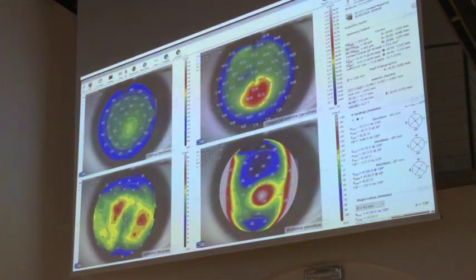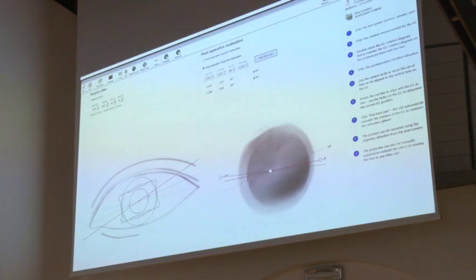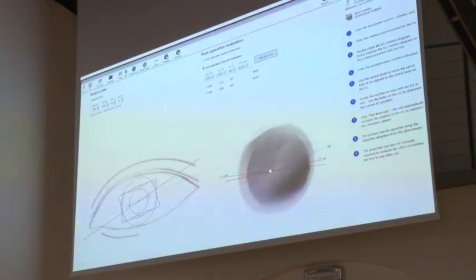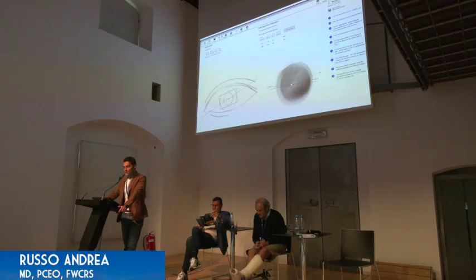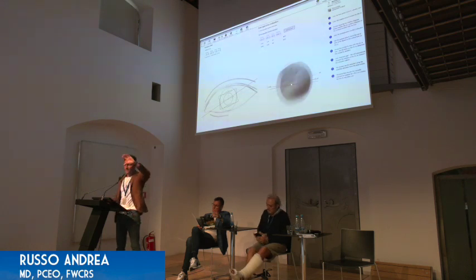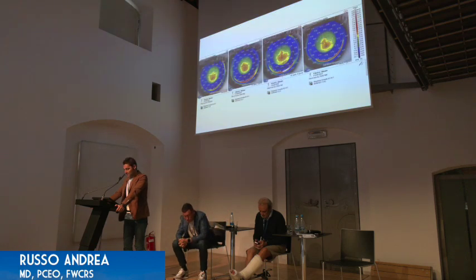This patient had keratoconus in both eyes, and this was the severe one. This is after the surgery. Everything was perfect, apparently, but the patient was complaining of ghost images, double images, even if we were on spot with the refraction. So we ran the Reinstein software to get the best positioning of the ICL according to the postoperative objective refraction. So we rotated the lens 20 degrees counterclockwise, and now this is a very happy patient.